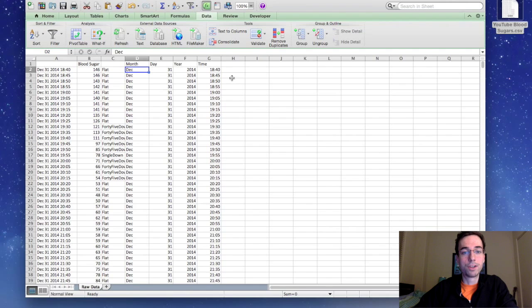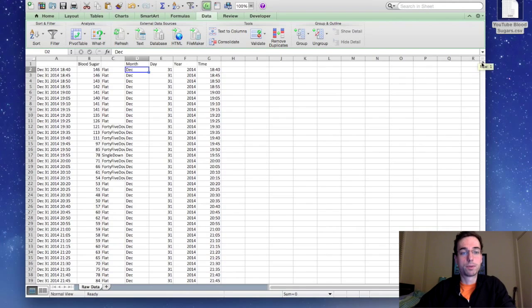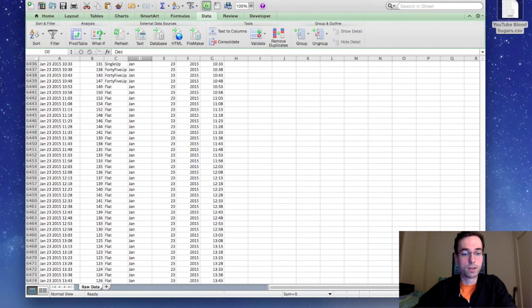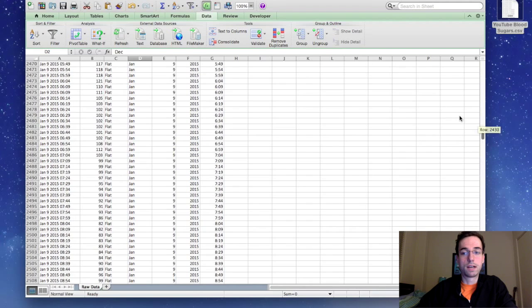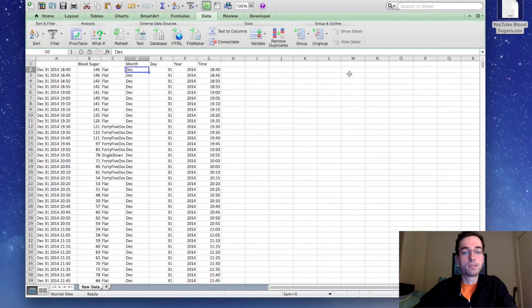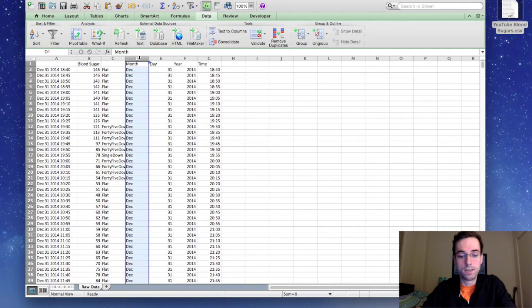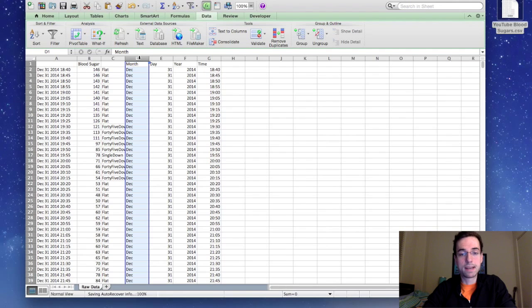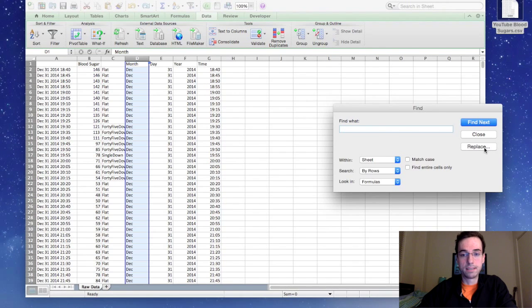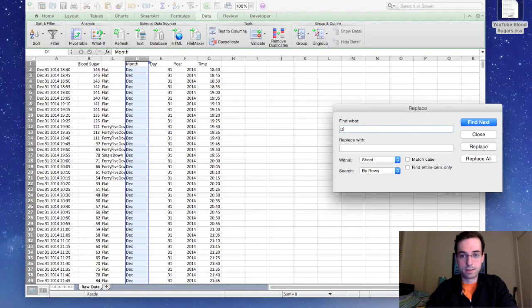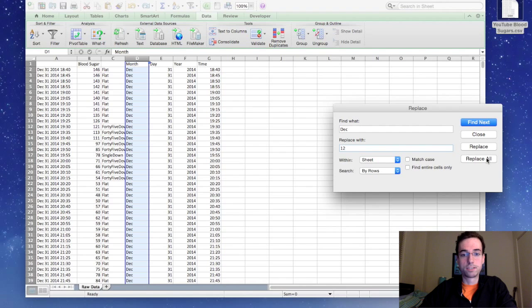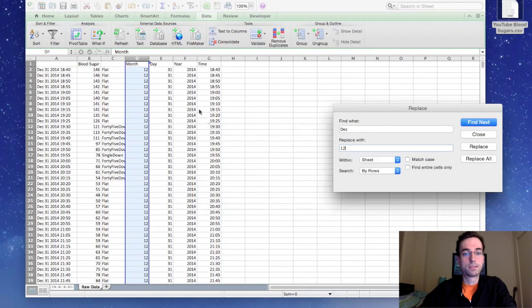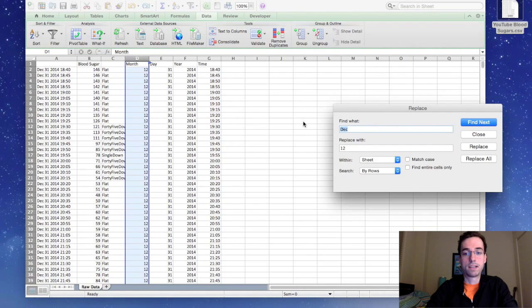Okay. The next thing we're going to do is we're going to need to change the month. So for me, my data goes from December 31st all the way down to January 26th. So I have two different months. I have December and January. And we need to convert the letters into numbers. So what you're going to do is you're going to highlight all of D, press command F, and then choose replace. And so for me, I'm going to say find December, D, E, C, and replace with, I'm going to put the number 12, and then I hit replace all. So 65 times, replace the month December with 12. And then I also have January, so I'm going to find Jan and replace it with 1.